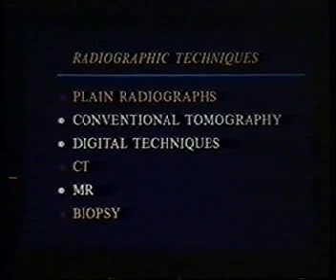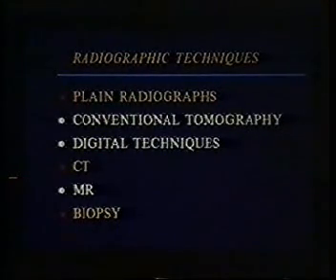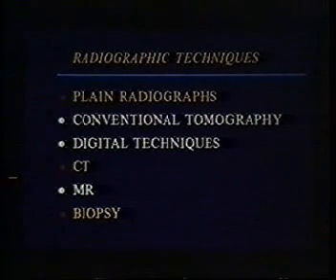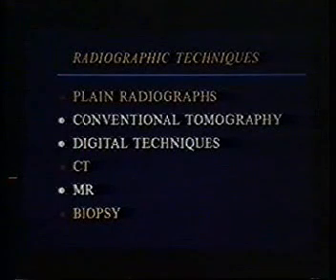Plain radiography, of course, which I'm going to touch on. I think everyone here knows the characteristics of solitary nodules on X-rays and what they're supposed to look for. CT I'm going to cover in depth because I think CT is an important diagnostic procedure these days in diagnosing pulmonary nodules, and using biopsy to diagnose lung nodules has been beautifully covered by Dr. Westcott.